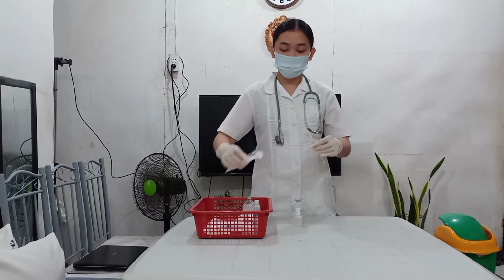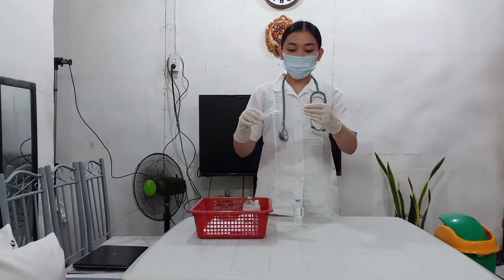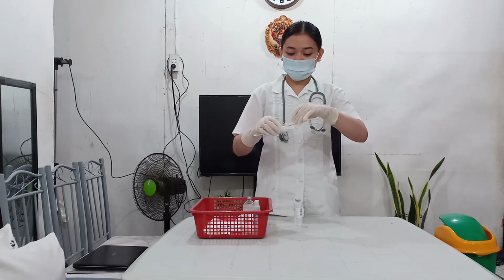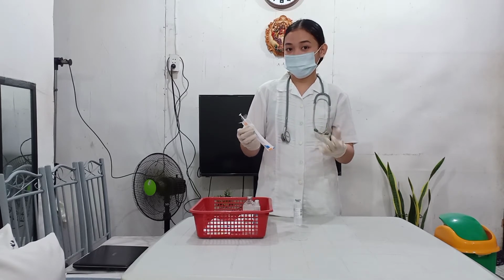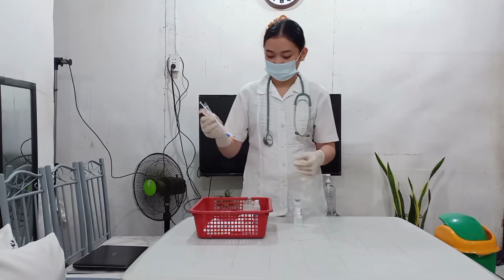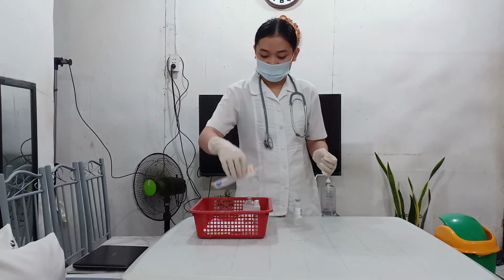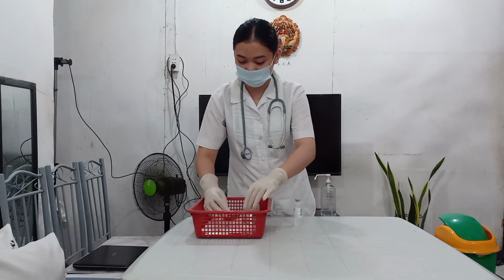So we are going to keep this tuberculin needle with the medication inside the plastic, and we are going to administer and remove this only on the bedside table of the patient. We are going to place it in the tray. Make sure it is free from contamination.